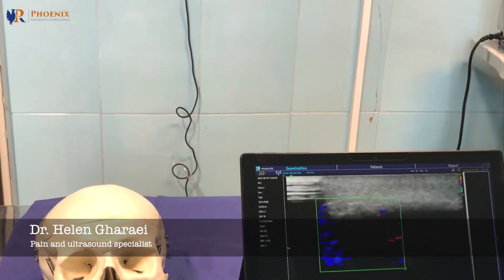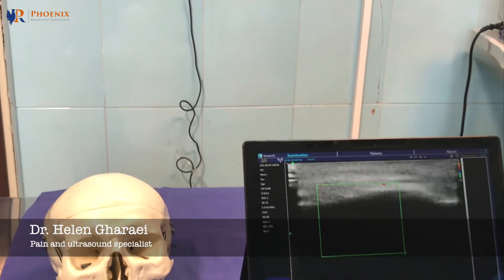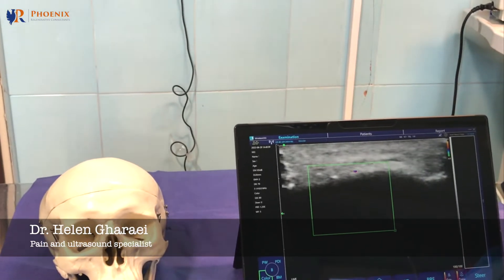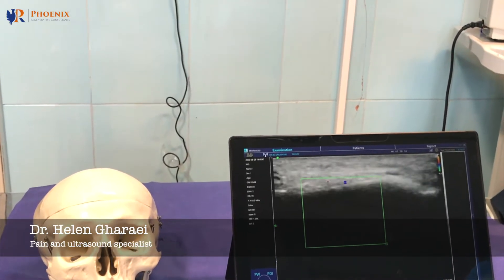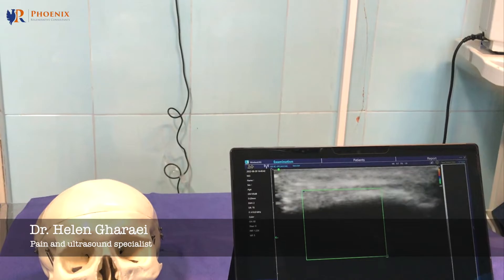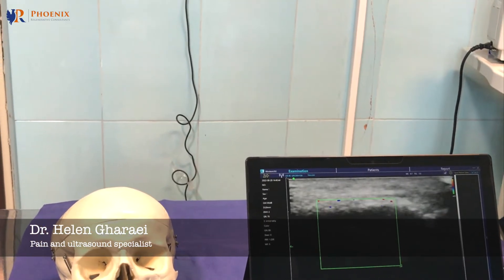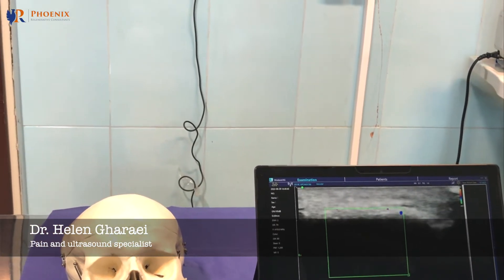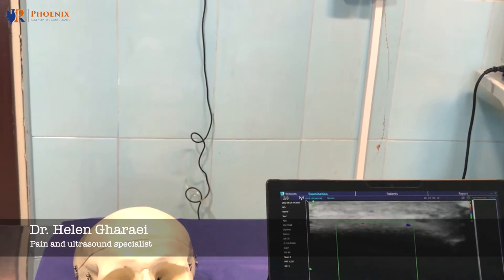Then move the probe more medially to see the notch. In the notch you will see the pulse of the supraorbital artery. You should not put too much pressure because the vessels are very superficial.